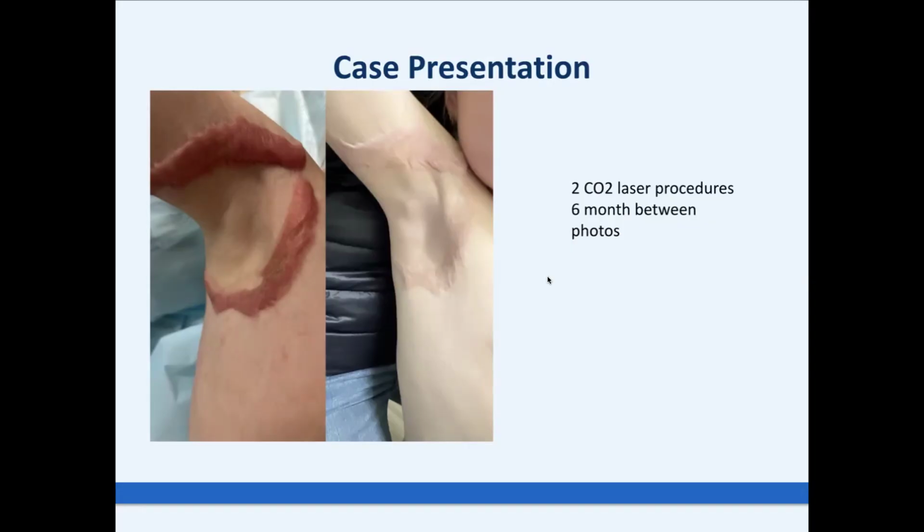They had betamethasone cream after the procedure, because CO₂ laser is ablative, so we have wounds, and steroids like betamethasone act through these wounds. So we have less height, more flexibility, more pliability.